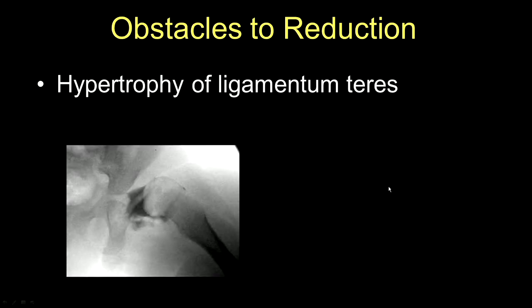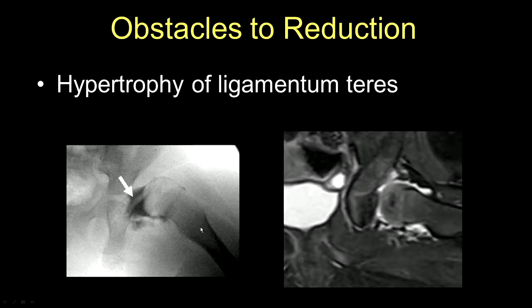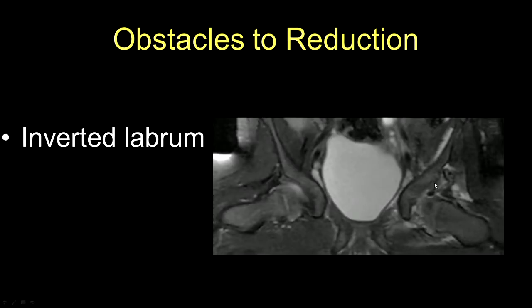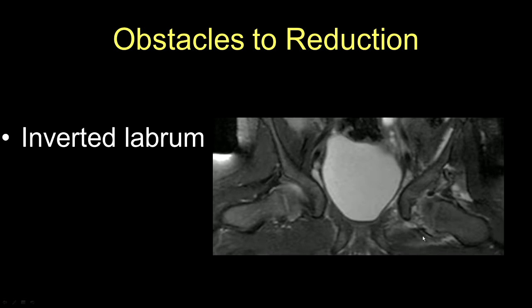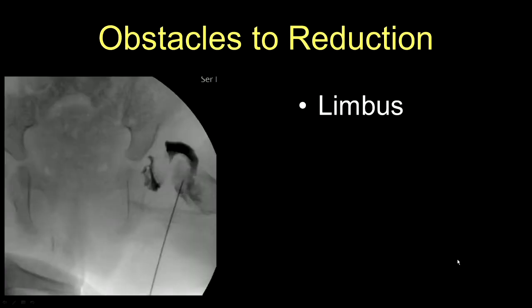Hypertrophy of the ligamentum teres: this is an image where contrast material has been injected into the joint. Notice this structure — a ligamentum teres that is very fat and is keeping the femoral head outside of the acetabulum. This patient also had a pulvinar. Here is an inverted labrum — the labrum normally is a little triangular fibrocartilaginous structure that should be nicely seated on top of the femoral head. In this case, it is inverted and keeping the femoral head away. And here is the limbus, that ridge, keeping the femoral head from getting into the depth of the acetabulum.